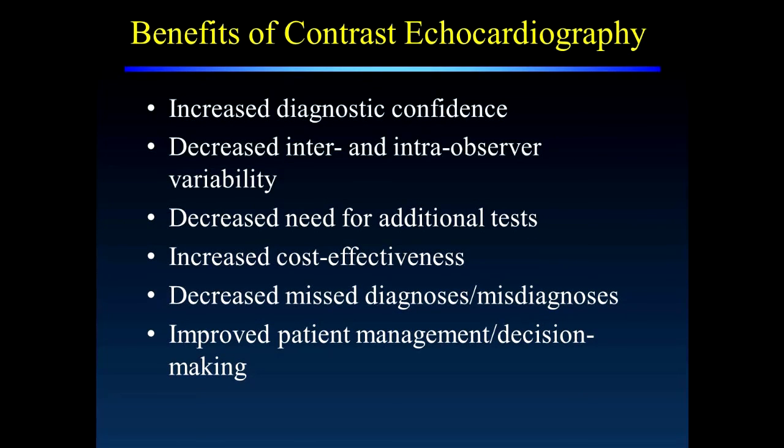If the images are good quality, then contrast echo has many benefits. It has been shown to increase diagnostic confidence, decrease inter and intra-observer variability, decrease the need for additional testing, which can improve cost effectiveness in patient management. It also helps to decrease missed diagnoses and prevent misdiagnoses. And all of these benefits will lead to improvement in patient management and decision making.